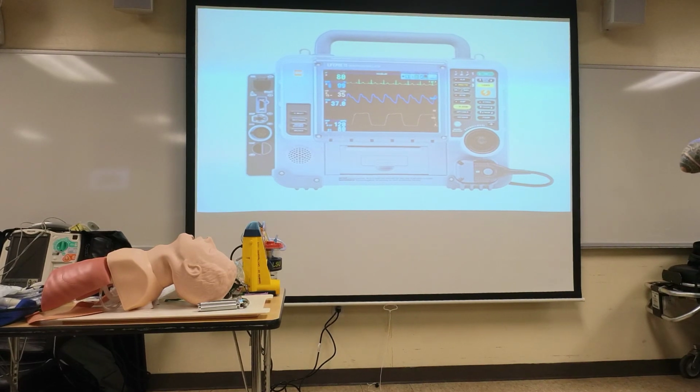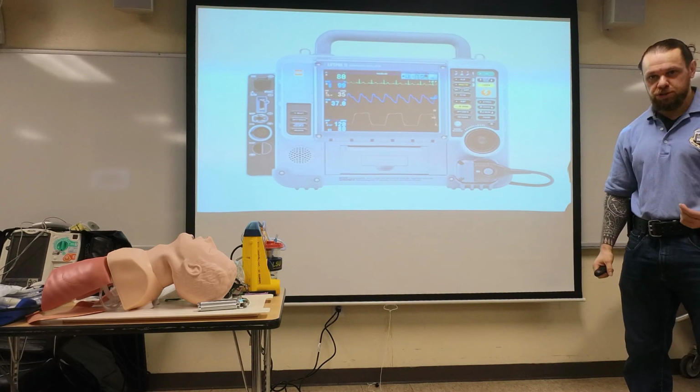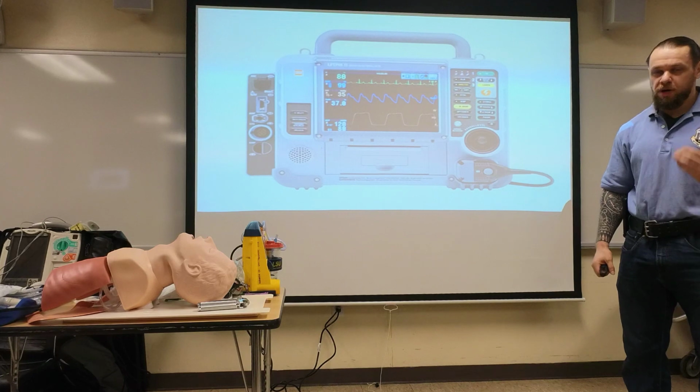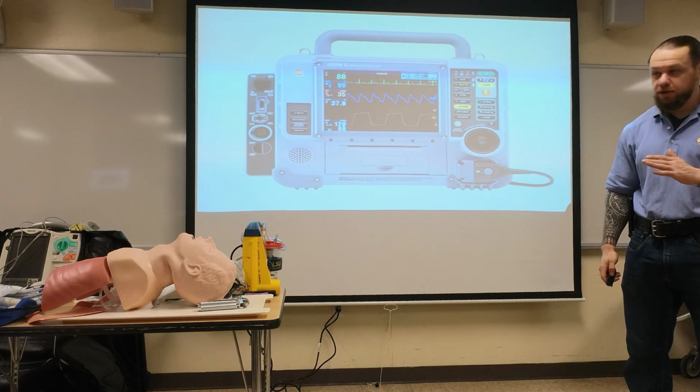So, first thing we're going to do are ABCs, for every patient. The moment you determine they have airway compromise, failure to oxygenate or ventilate, you're going to start with your BLS procedures. By the way, BVM ventilations, the BLS procedures, are the most important. It's not the intubation. Most paramedics, EMTs, doctors cannot do this right. I'm going to go through how to do it right. It's the vital thing you're going to do.